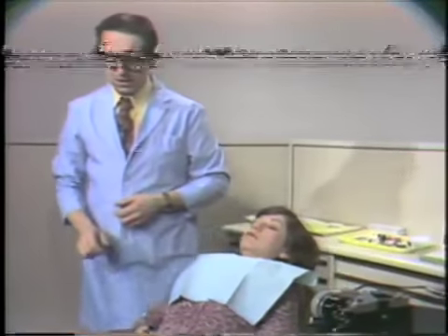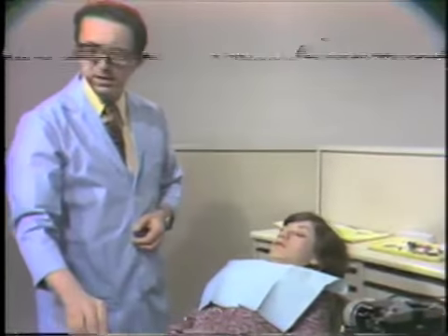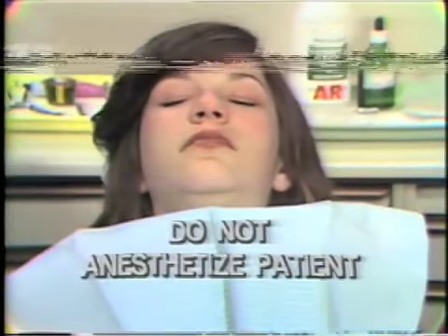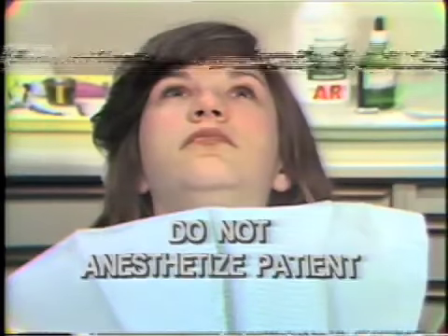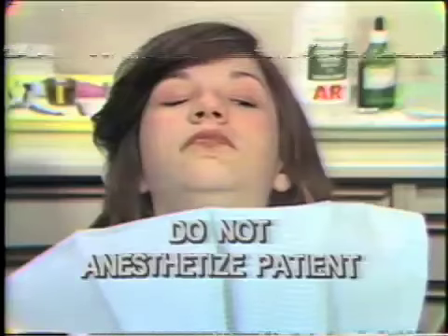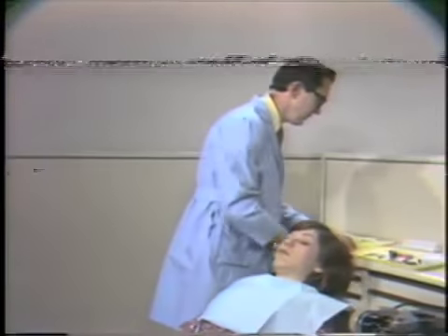Now one thing I caution you is that this may be a little bit uncomfortable for the patient, especially when we ligate the teeth. But by all means, do not anesthetize this patient, because we're going to be applying heat to the pulp. And if the patient is anesthetized, we could kill the pulp. Now let's go ahead with the ligation of the teeth.